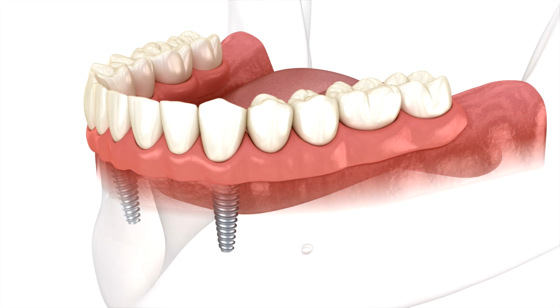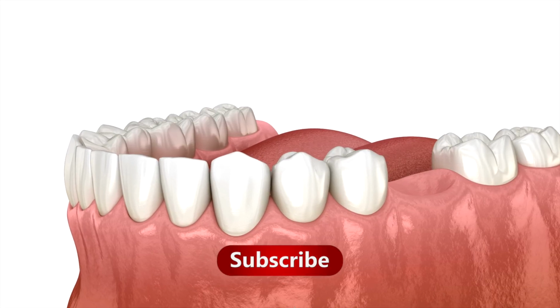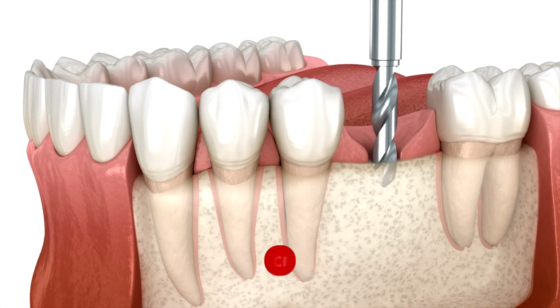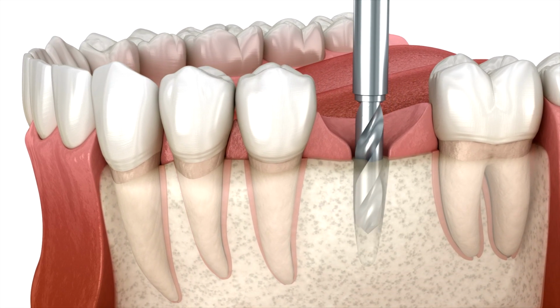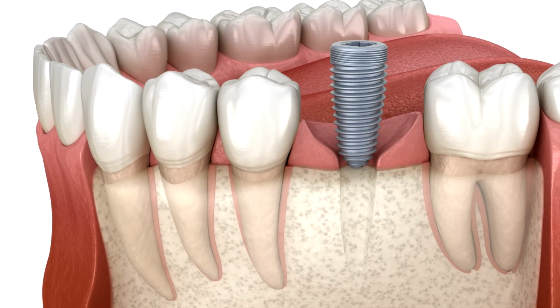For a surgeon, these distinctions are critical. Dense bone provides excellent primary stability but risks overheating during drilling. Soft bone requires a different drilling protocol and often cannot support immediate loading. Many implant failures occur because the surgeon misjudged the density and used an inappropriate drilling technique.